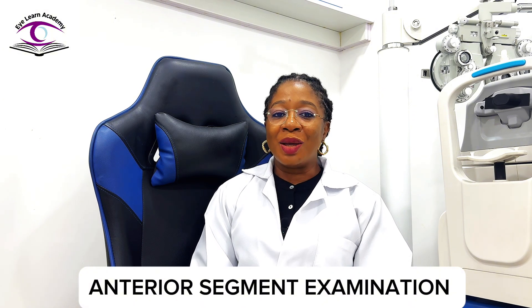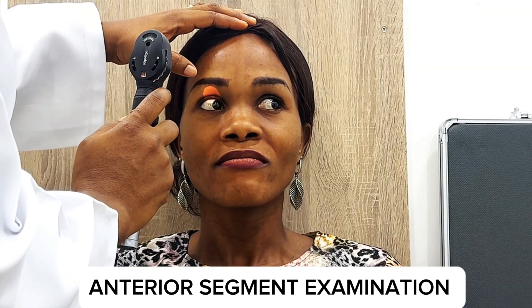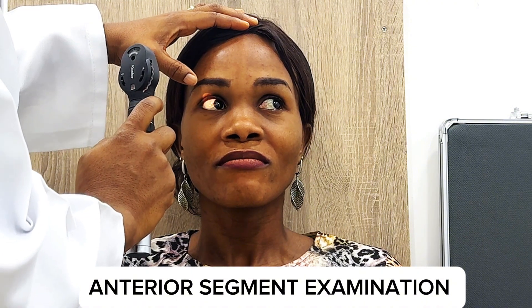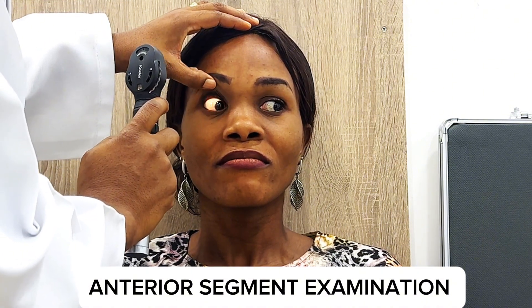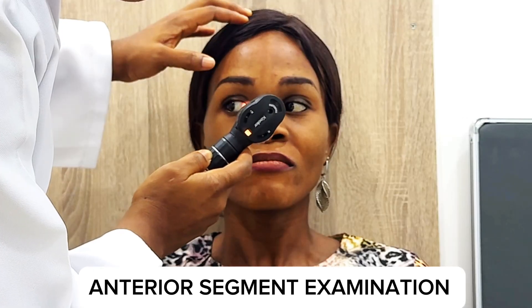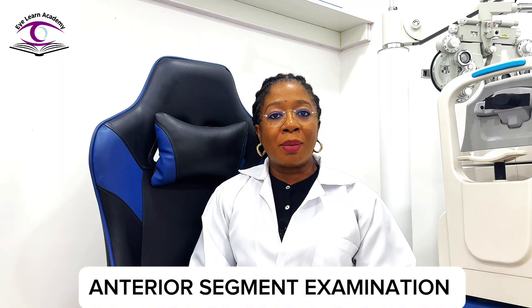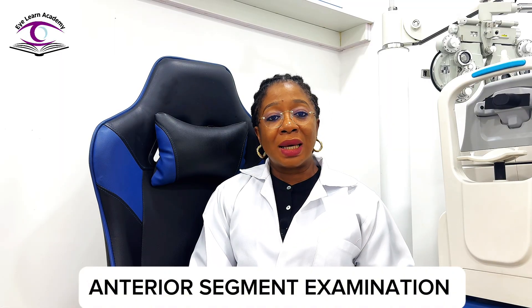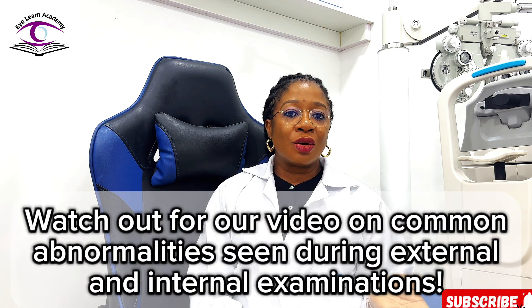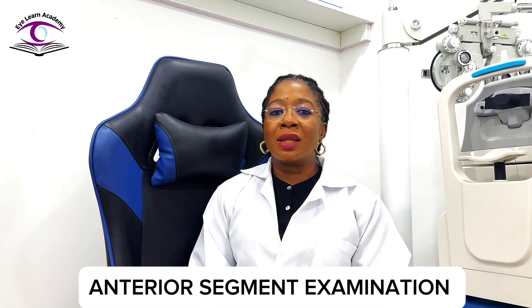From there, you're looking at the conjunctiva. When you're looking at the conjunctiva, your patient should be looking at the nine cardinal directions of gaze — this is important so you can access all parts of the conjunctiva. While the patient is looking down, you can lift the upper eyelid to access the conjunctiva properly. What are you looking out for? You're looking out for redness, raised or rough areas, and irregularity of the blood vessels.